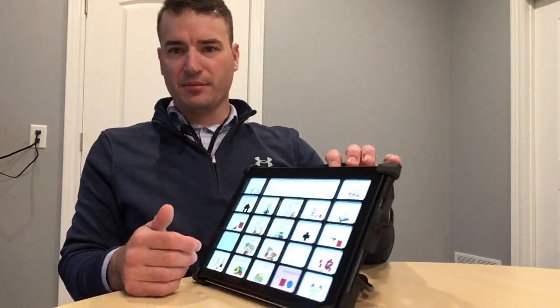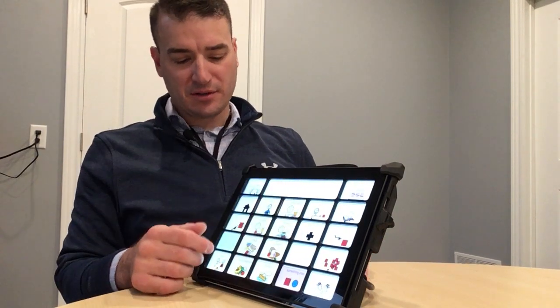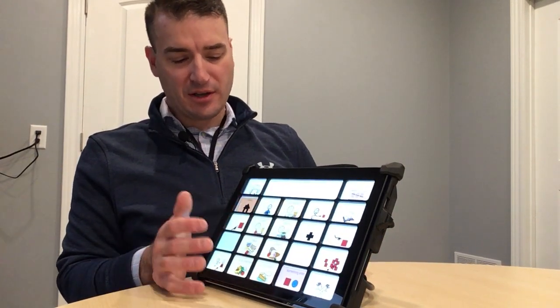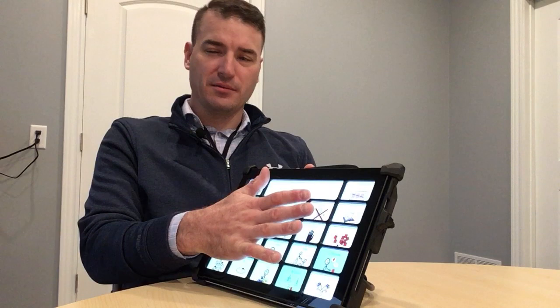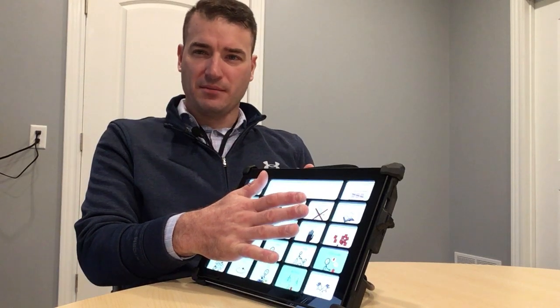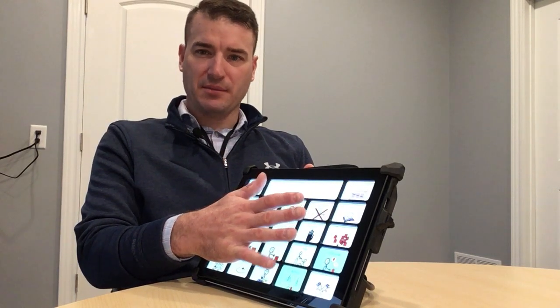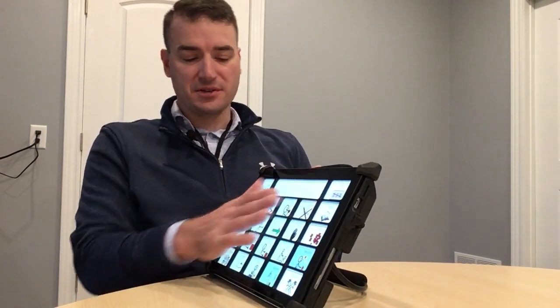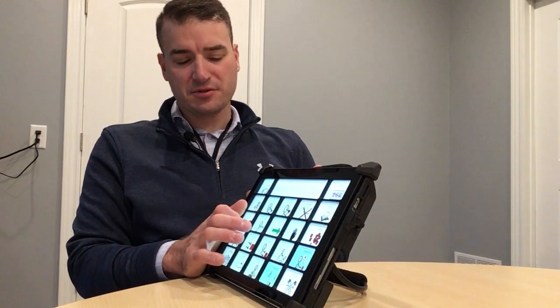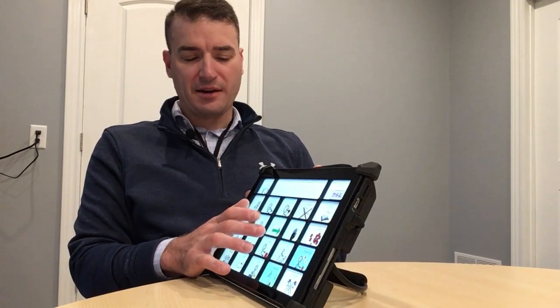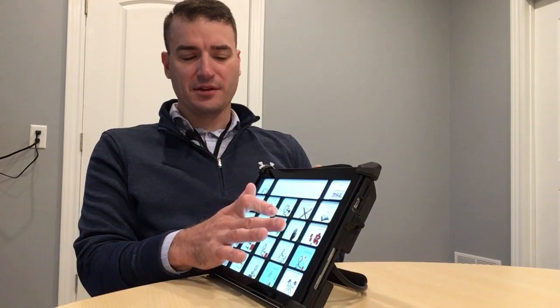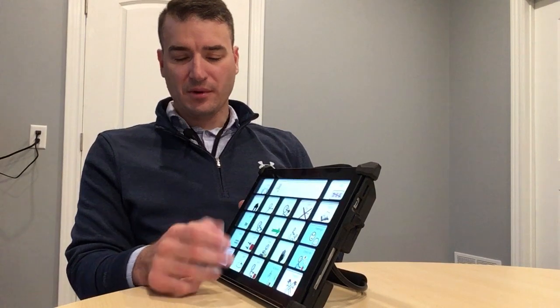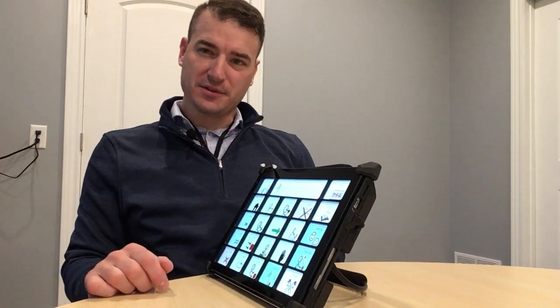This is a 20 location key guard, and I could use this key guard to help guide my hand and make my selections without making selections that I don't want to make. Our users will ladder their fingers around the key guard and then drop in wherever they want to make their selections.